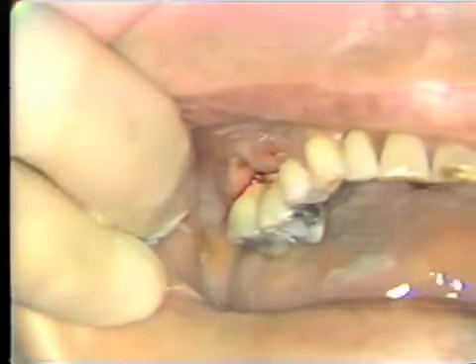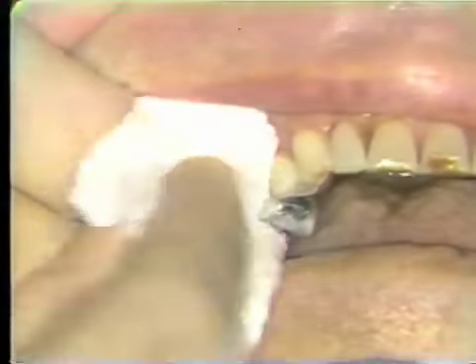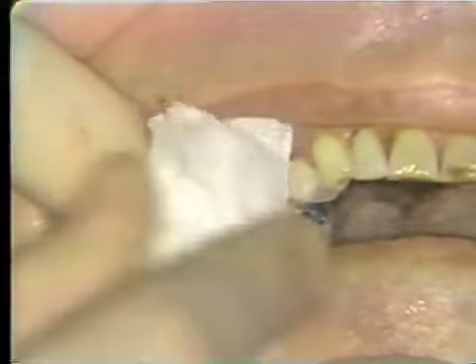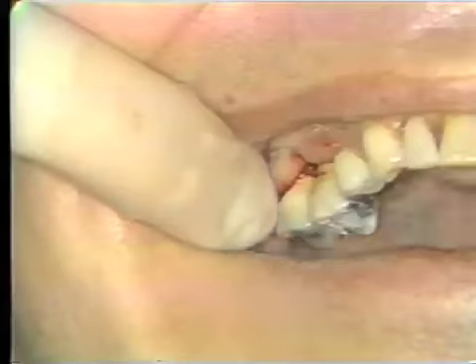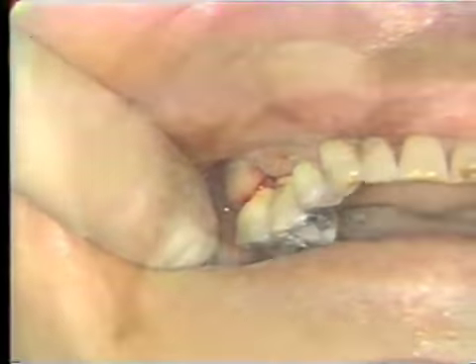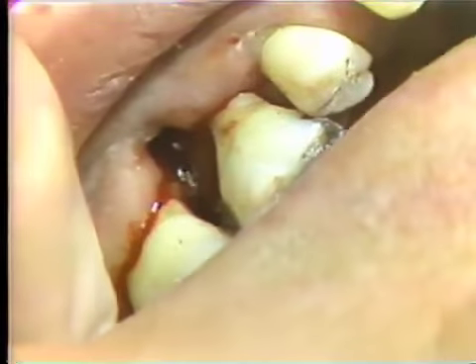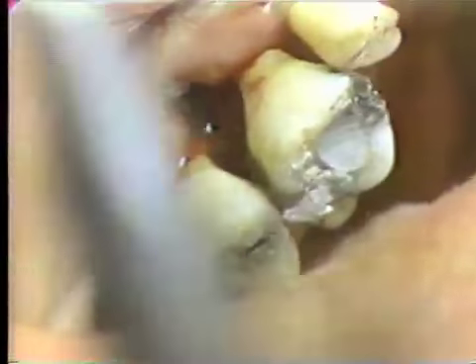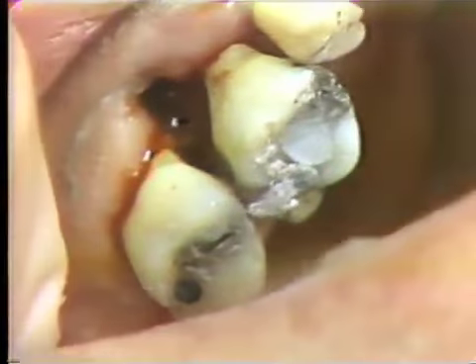At this point, hemostasis is necessary. And the final procedure is to smooth and recontour the remaining root sections.